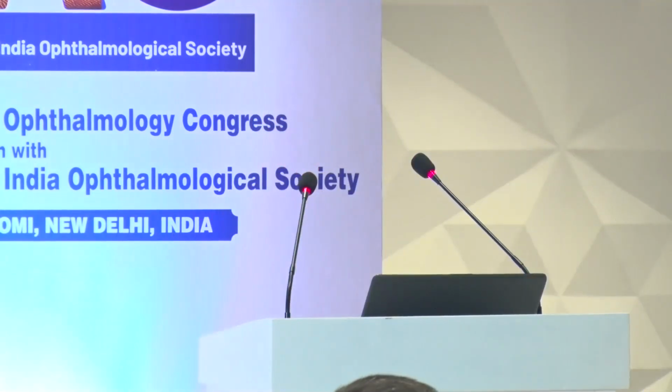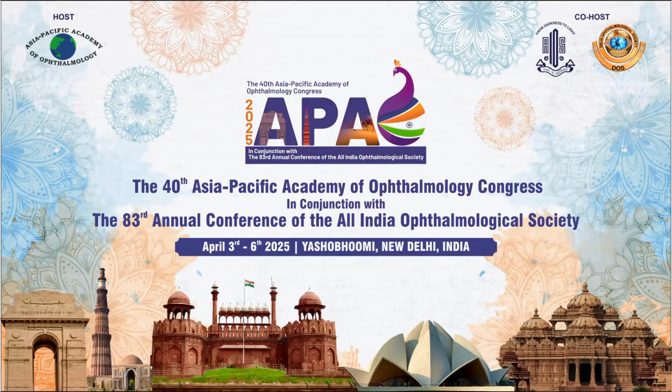Thank you very much, Dr. Vinod, for the wonderful presentation. And now you have so many options of pupil expander available. But I think still a lot of people use iris hooks, which are more comfortable, reasonable, and cost-wise.